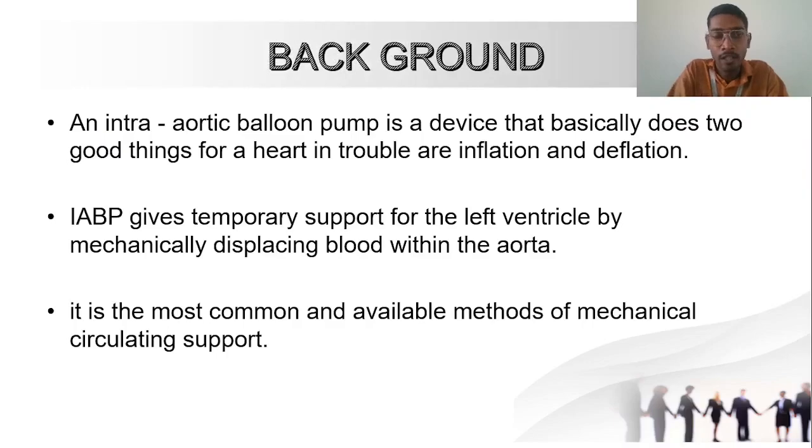Have you heard of the intra-aortic balloon pump? It is a device used in the hospital sector. As a cardiac technologist, and also as a cardiac perfusion care technology student, you have to know the intra-aortic balloon pump, what its functions are, and how it works.